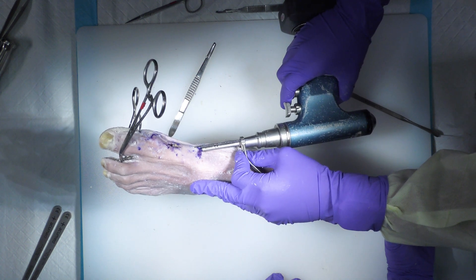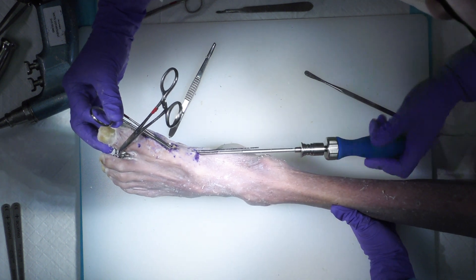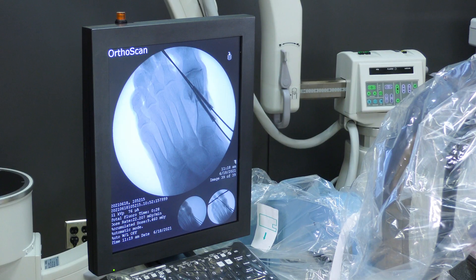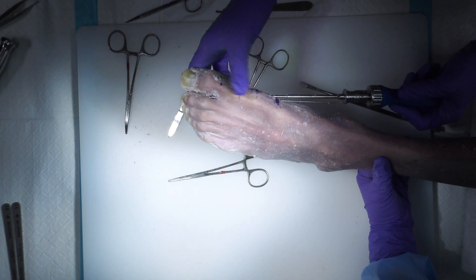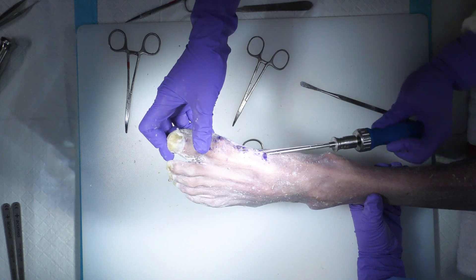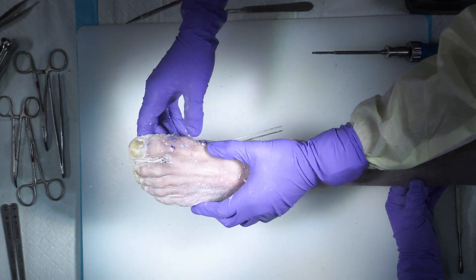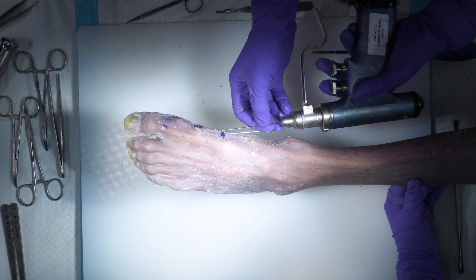I'll drill all the way across and hold my position as I'm putting this first screw in to make sure that the reduction I got is maintained. Just a couple more turns — the biggest thing is maintaining the osteotomy where you want it. As soon as those threads start to purchase that first metatarsal head, you're okay. Once you get it where you want it, make sure that osteotomy is secure — it feels nice and secure. We've got two-screw fixation with the AccuTrack; I'll remove these wires once I'm satisfied.